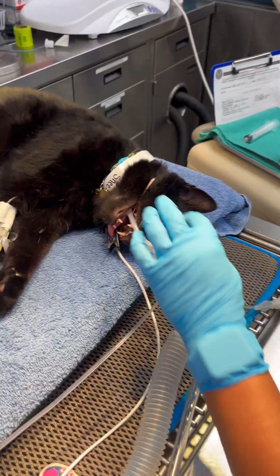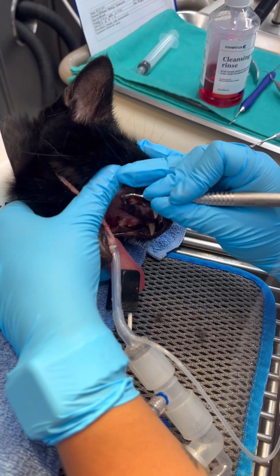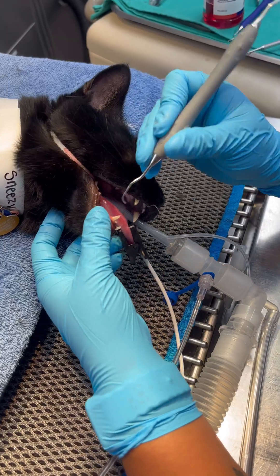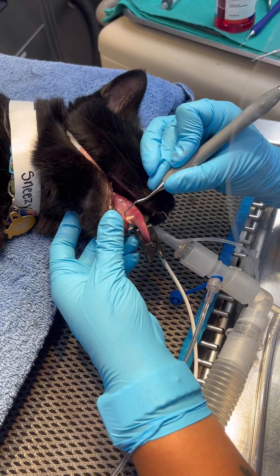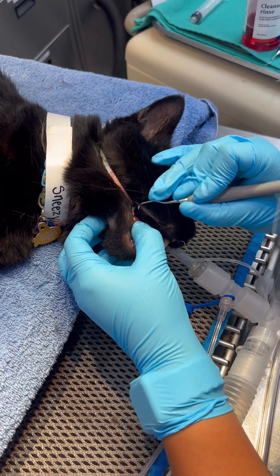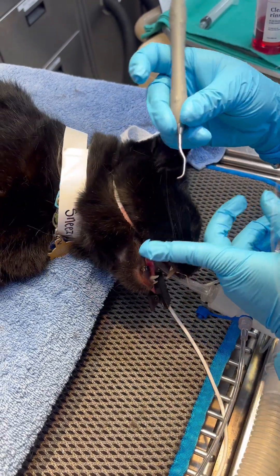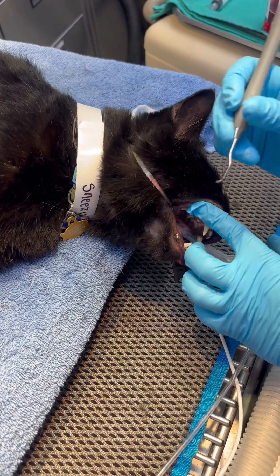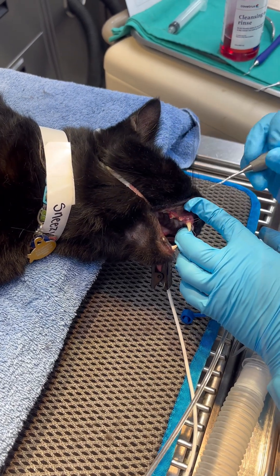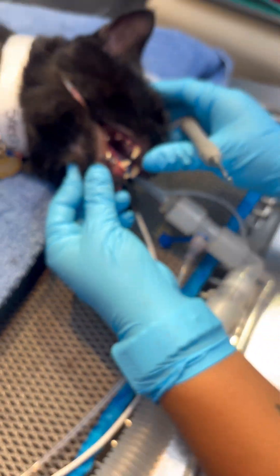Now we're on the other side of this patient's mouth, going in with the scaler again. Let's skip over the tooth with the exposed pulp in it — you don't want to scrape that. There we go, he's got some exposed pulp in there for sure, but you did a good job cleaning up the other teeth. Okay, fantastic.